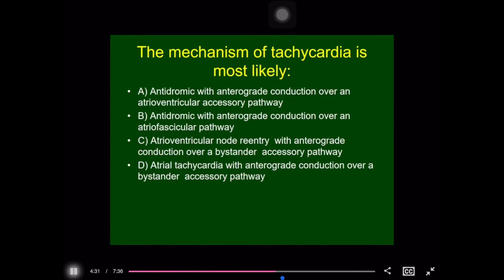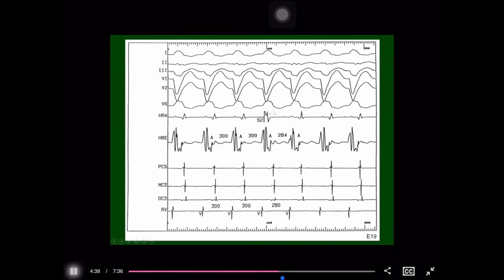Now, if you go back and say, how do we rule out these two? We rule out the other two by the following. If you have an atrial tachycardia, remember the activation sequence is in the septum, right, during tachycardia. So therefore, if this is an atrial tachycardia, you put a PAC in and you bring in the next A at a time where the septal A was already activated. How do you do that? You can't do that. You can't bring in the A when you didn't even get to the A. So that rules out an atrial tachycardia.